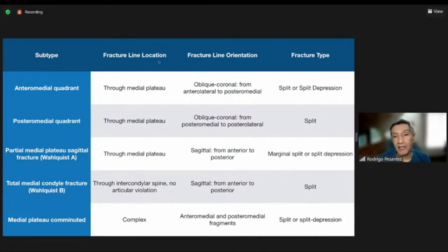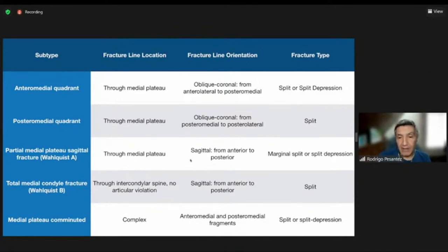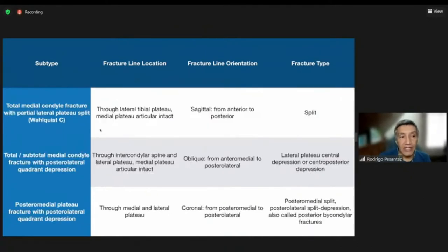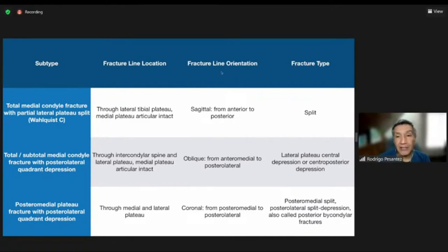This CT-based classification addresses fracture line location, fracture orientation, and fracture type. In the complex fractures, you can see total medial condyle fracture with partial lateral plateau split (Welikis type C), total/subtotal medial condyle fracture with posterior lateral quadrant depression, and posterior medial plateau fracture with posterior lateral quadrant depression. The fracture line orientations in these complex types run from sagittal, oblique, to coronal planes.